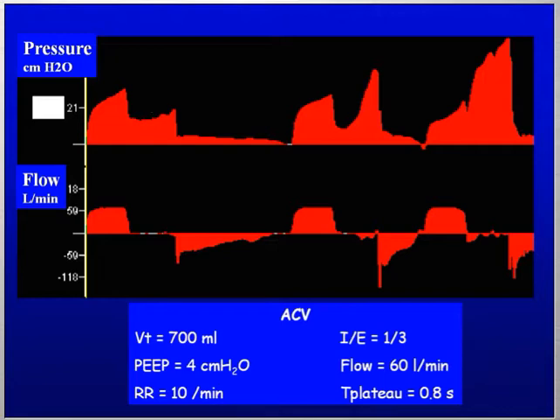And what you see here is clearly the patient trying to fight against the ventilator because he wants to stop the breath, whereas the ventilator tried to impose a pause at the end of inspiration. So the problem of this synchronization between the duration of patient's inspiration and ventilator insufflation or inspiratory time is also very important.